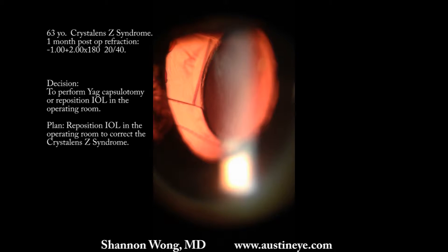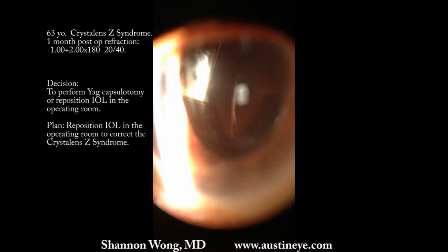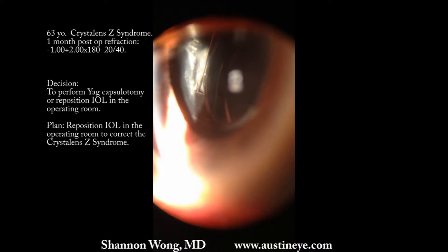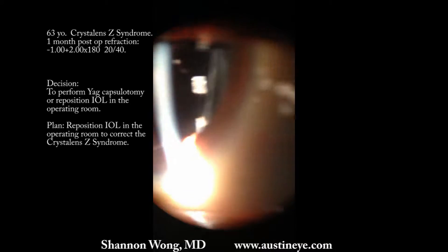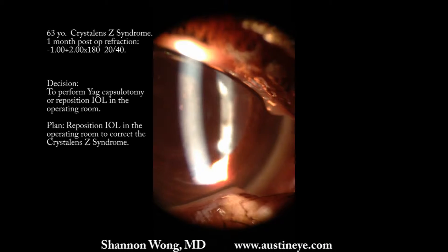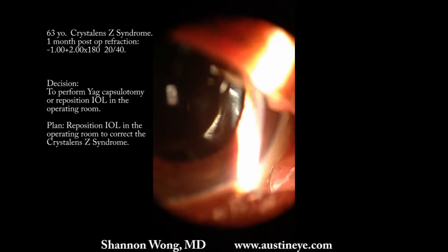There is a choice that we made not to YAG this patient, but rather take the patient to the operating room to try to reposition the lens.